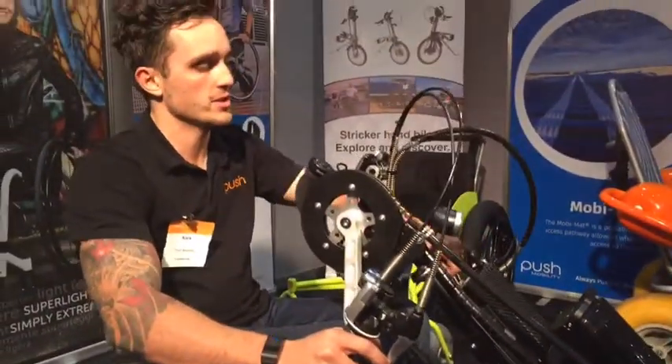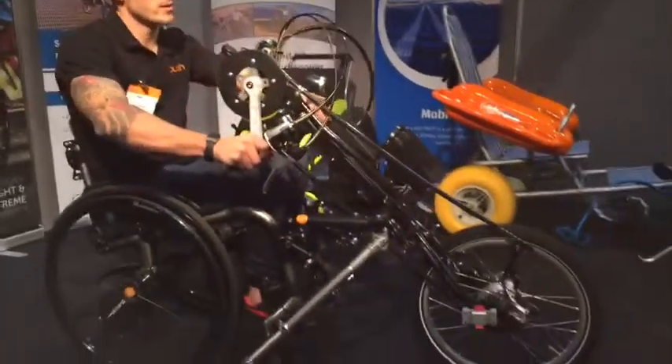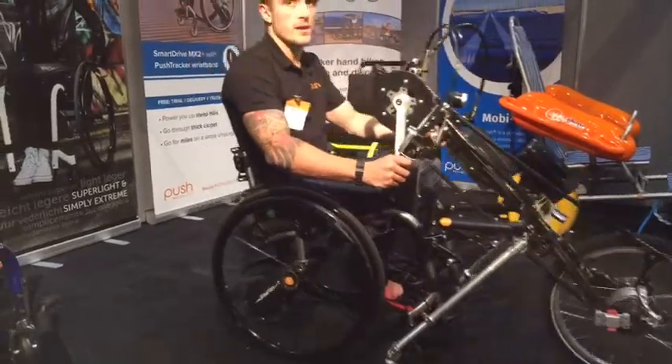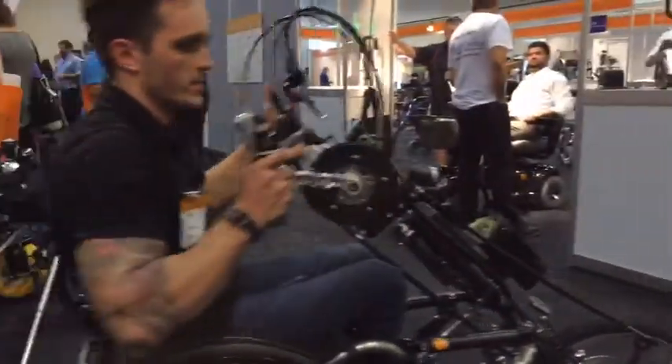And from here it's literally just turned on and away you go. There's a throttle over here on the left, and pedal away.